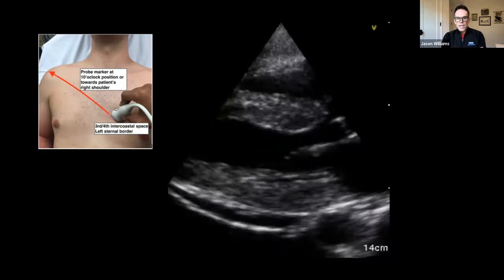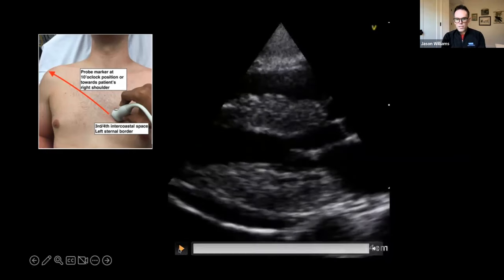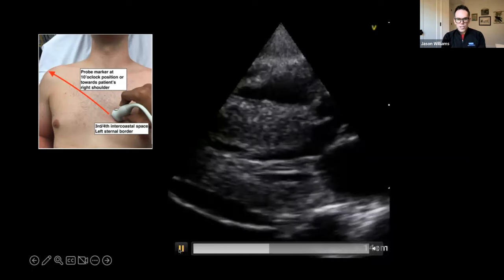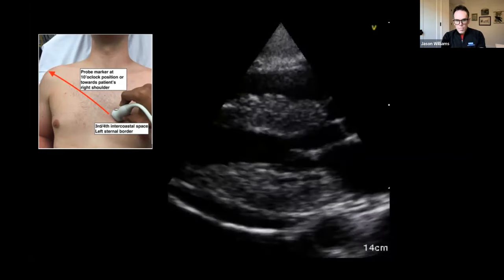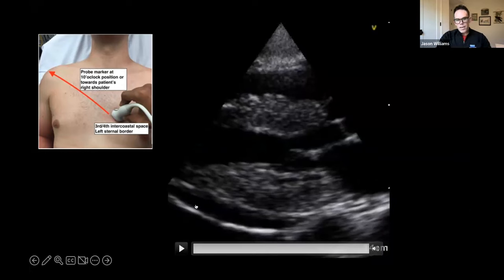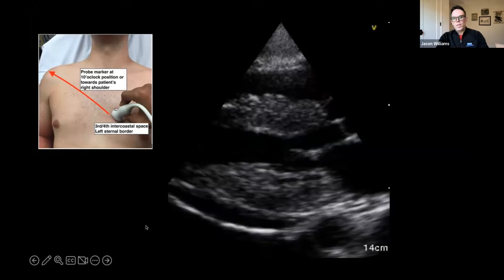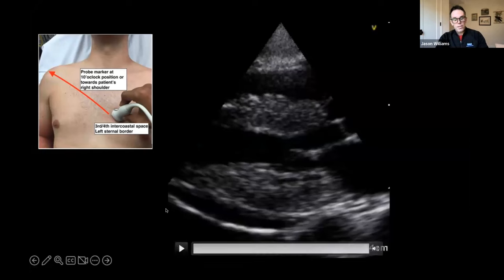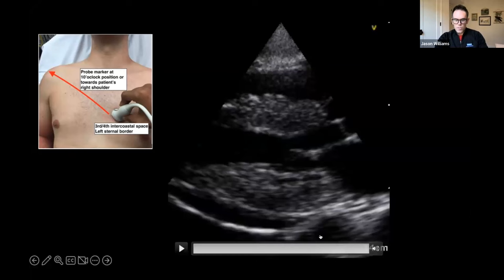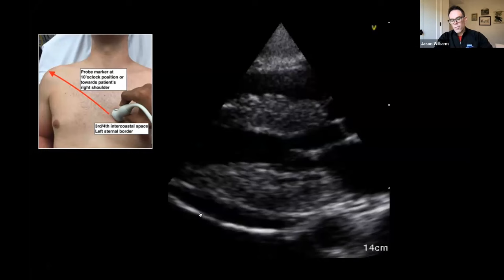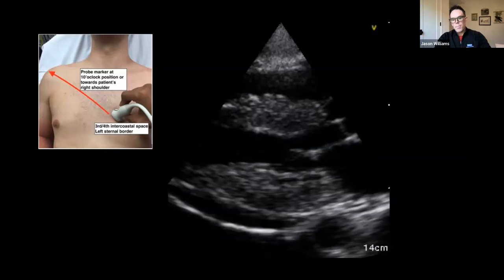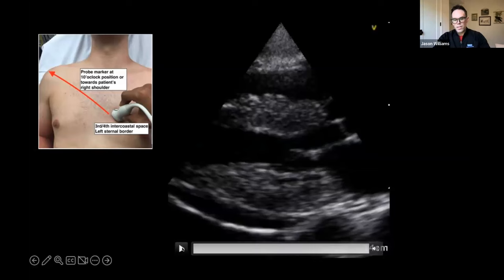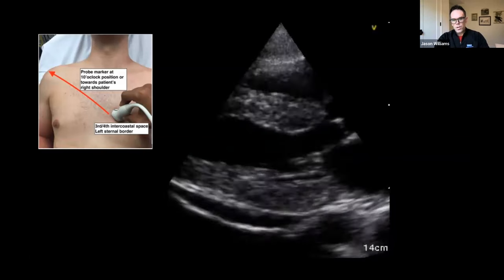And then finally, the last thing we should always ask ourself is, is there any pericardial effusion present? Sometimes we kind of just stop at ejection fraction and just kind of move on. So if I look at the top of the screen, it's not obvious there's any pericardial effusion above the right ventricle there, but towards the bottom, my eye is drawn to that anechoic black space there with the white pericardium just below it. And one thing we should think about is like, is this a pleural effusion? Cause we know the patient had a pleural effusion. Maybe we're just looking at fluid in the thoracic cavity in the lung and not in the pericardium. But if you highlight the descending aorta at the bottom of the screen on the right there, it's a kind of a black circle. Yep. You're circling it right there. This fluid is going above that descending aorta. And that means that is a pericardial effusion, not a pleural effusion in this case, versus if the fluid goes deep and down the screen. It may be a pleural effusion if it goes deeper than the descending aorta. But in this case, it does look like the patient has a pericardial effusion.